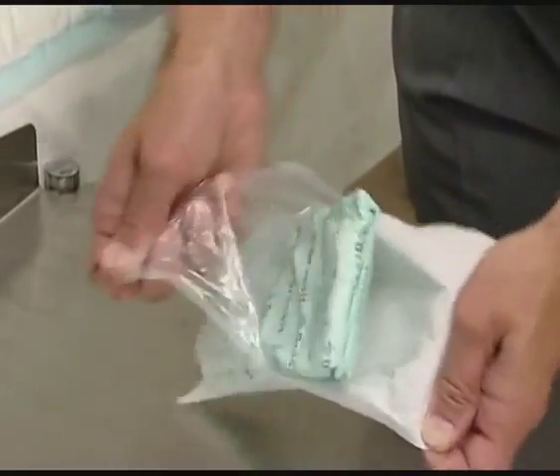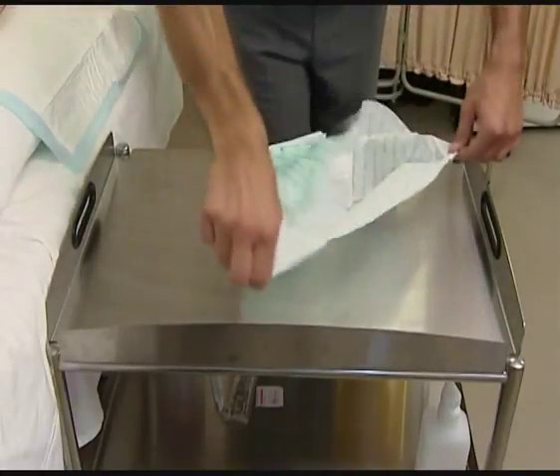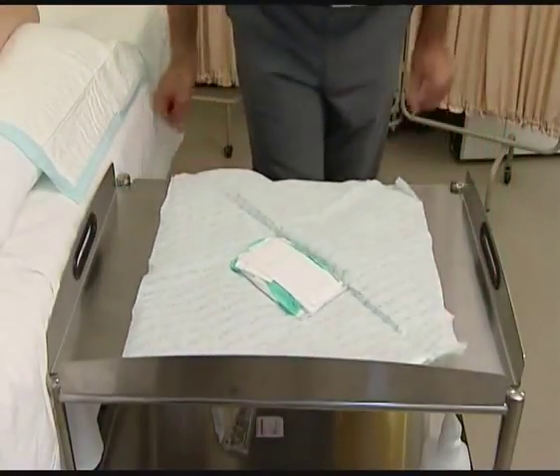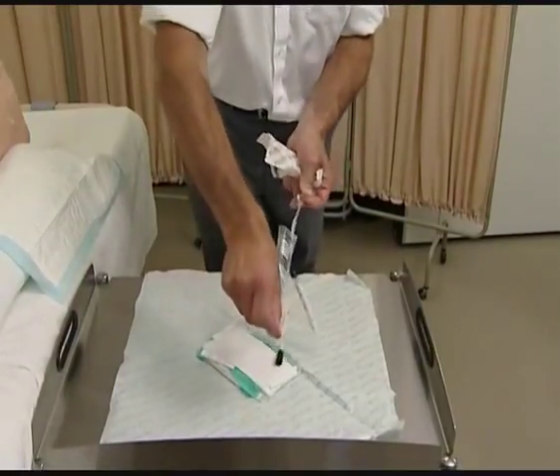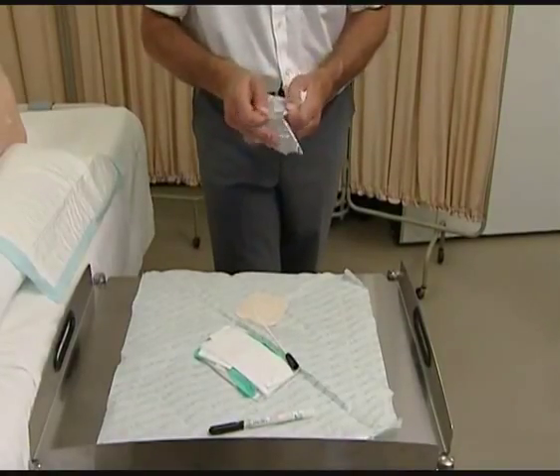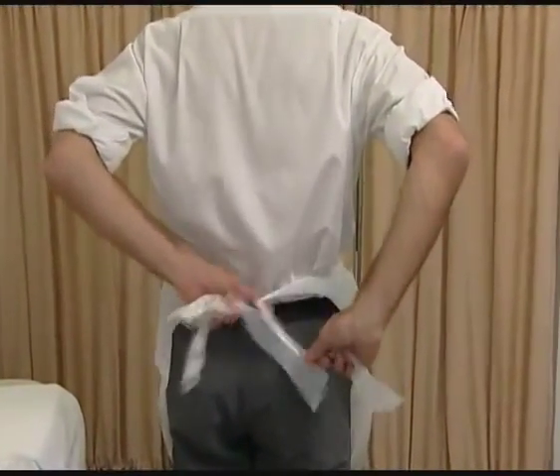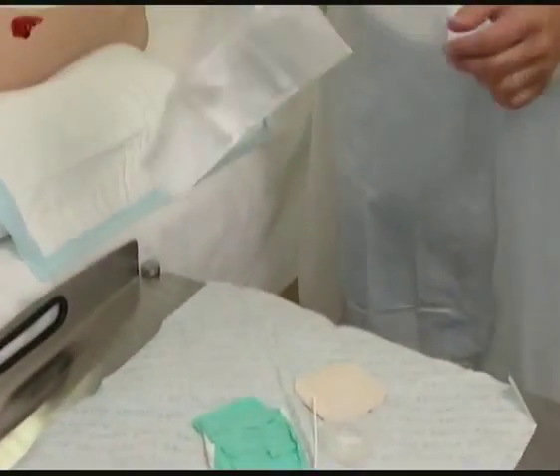Open the pack and, using the corners of the inner drape, spread the field onto your working surface. Open dressings and other materials such that they fall into the centre of the field. Then arrange the sterile field for your convenience.